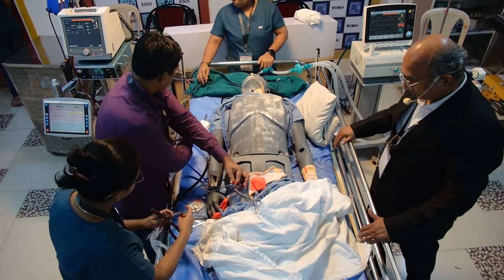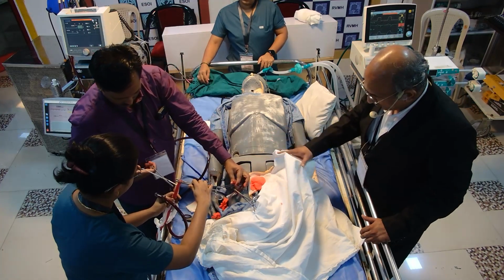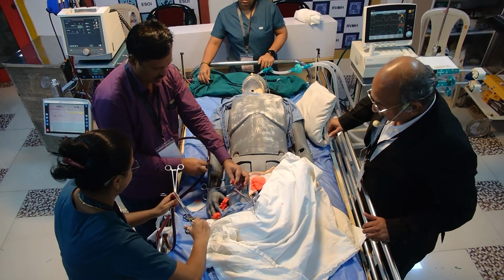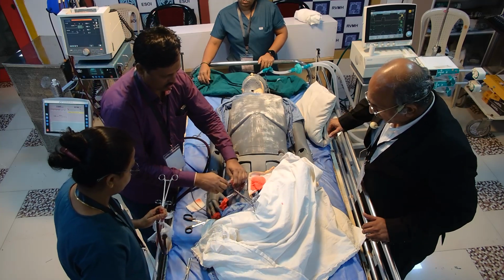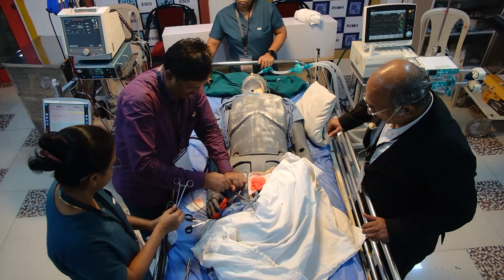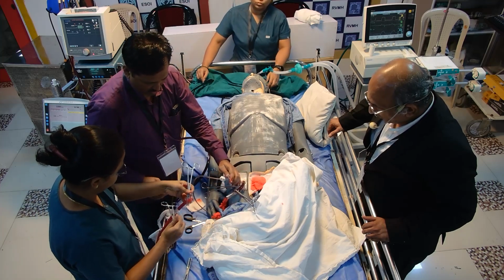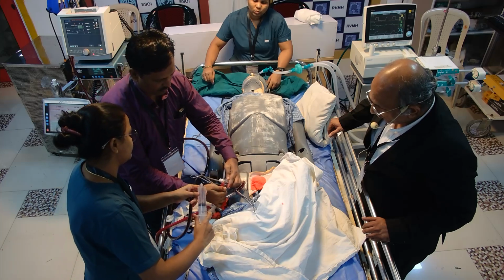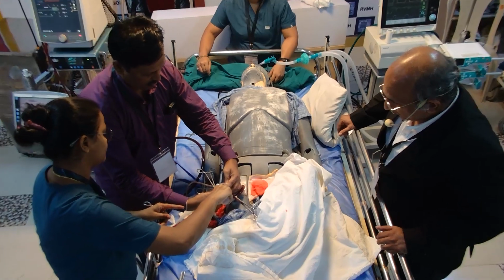Okay. So now I'll show you how to connect the bridge if it is not connected to the circuit. For connecting the bridge, you have to disconnect the circuit for some time. But again, this patient will tolerate it because the patient has improved and is tolerating weaning, so he will tolerate this.